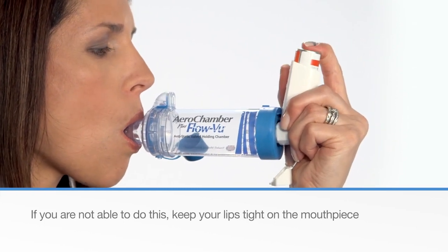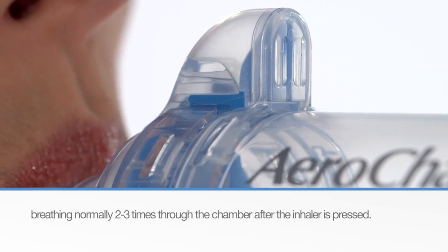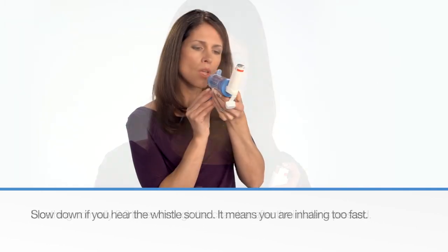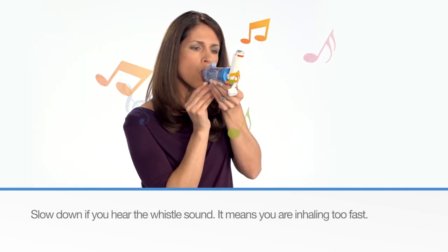If you are not able to do this, keep your lips tight on the mouthpiece and breathe normally 2-3 times through the chamber after the inhaler is pressed. Slow down if you hear the whistle sound — it means you are inhaling too quickly.